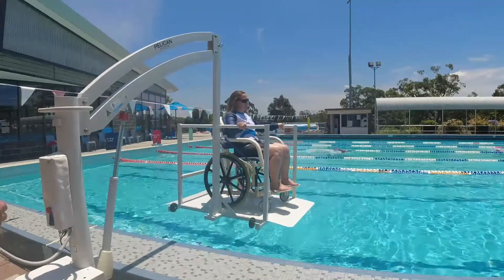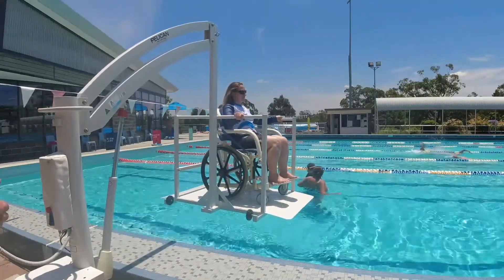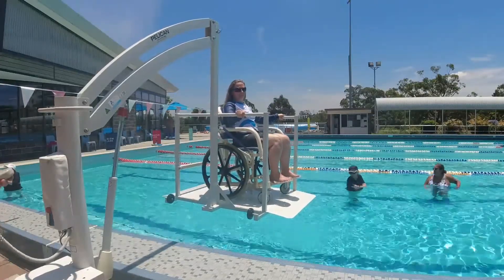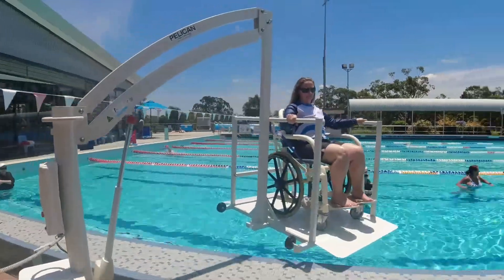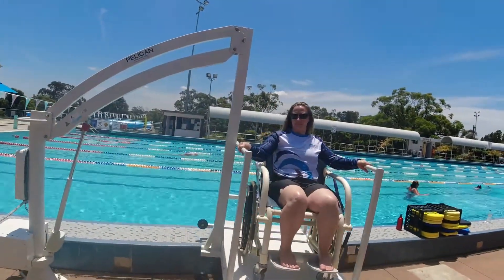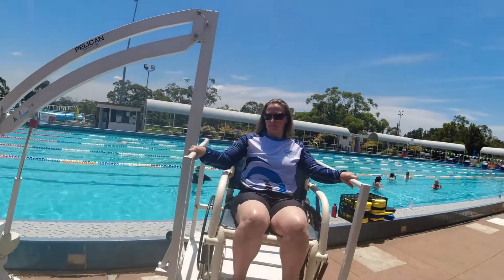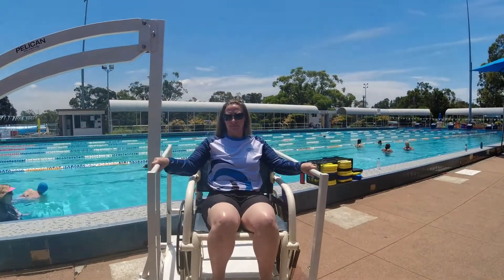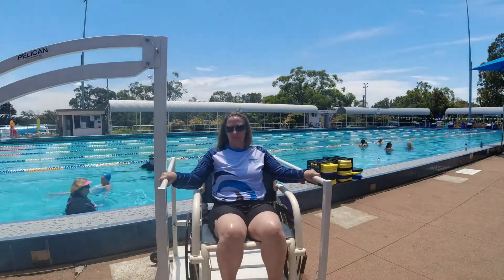As mentioned before, the platform has solid fixings and structural design with no swing motion, so all movements are through the power rotation and at low speed. You will also notice that Kim has placed her hands on the platform rail — although this isn't essential, it's another option available if the person's ability allows.